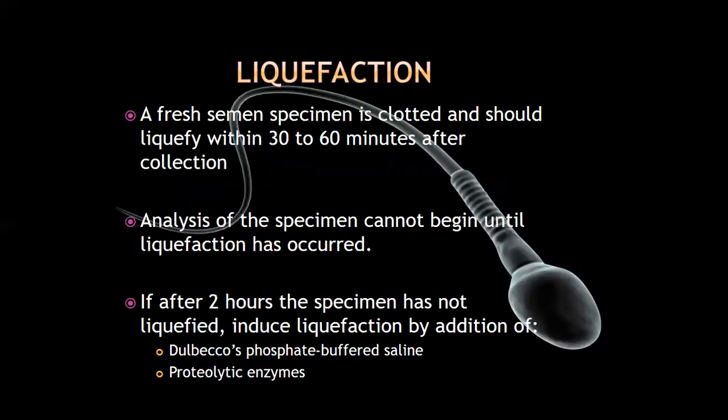So after you have collected the specimen and examined the color and the odor, you let the specimen stand at room temperature for 30 to 60 minutes. What's the purpose of standing?